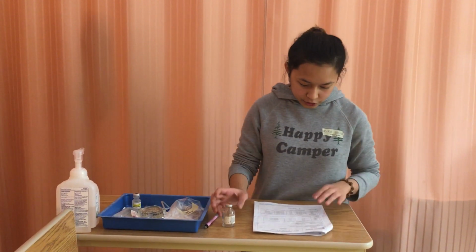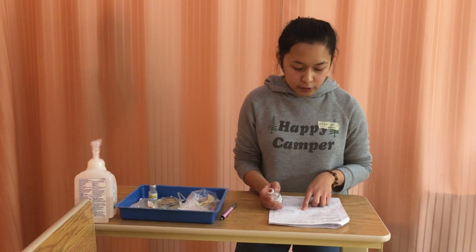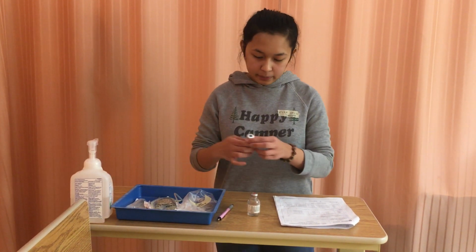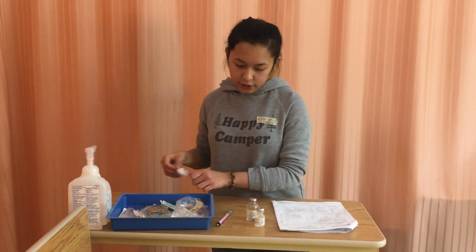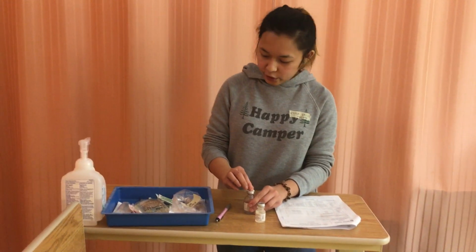Now for reconstitution, it says on the monograph that I would have to add 8.2 milliliters of normal saline for a final volume of 10 milliliters and a final concentration of 500,000 units per milliliter. So I'm going to get my normal saline. I'm going to swab for 30 seconds and let it dry for 15.